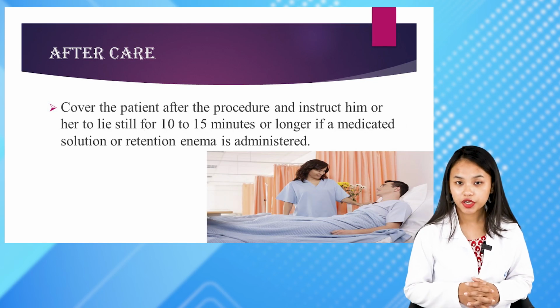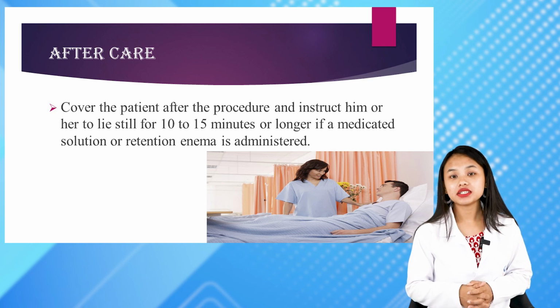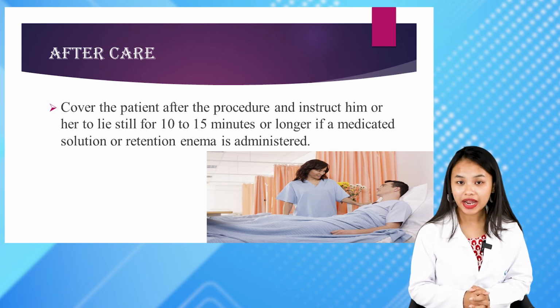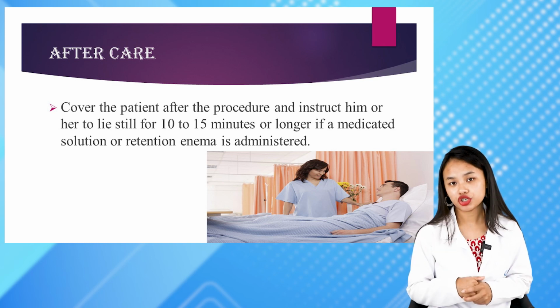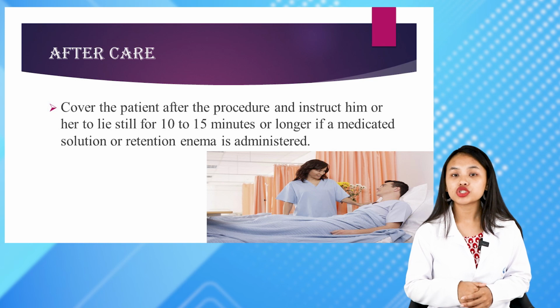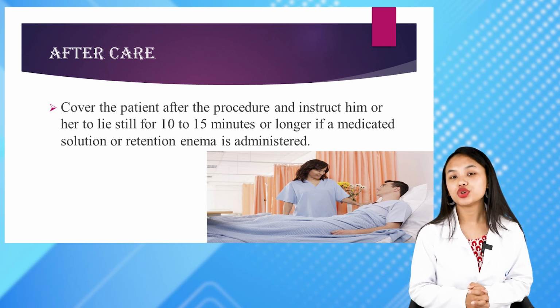We must cover the patient once the procedure has been performed, and we must advise them to lie down for at least 10 to 15 minutes. And if the patient has been provided with a medicated or a retained enema, then we must cover the patient after the procedure has been done, and we must also tell them to lie down in bed for at least 10 to 15 minutes in order to allow time for the solution to take effect.